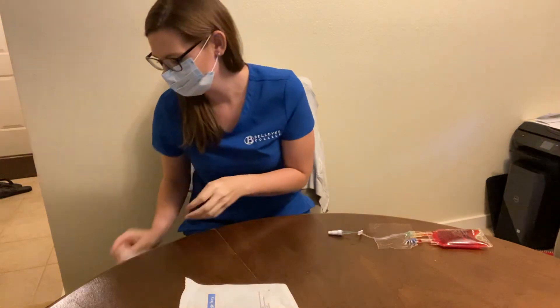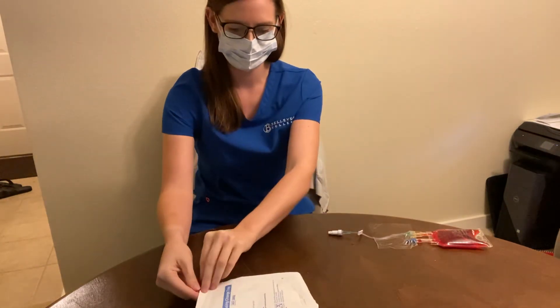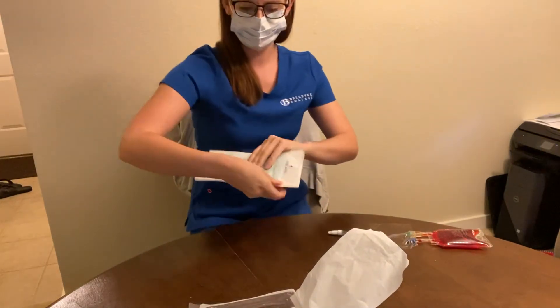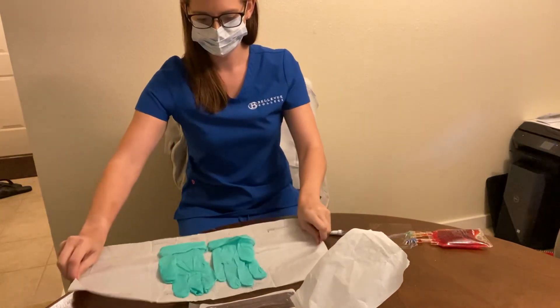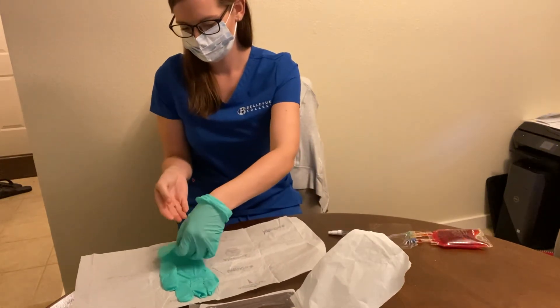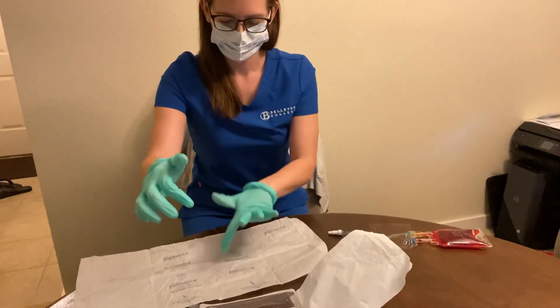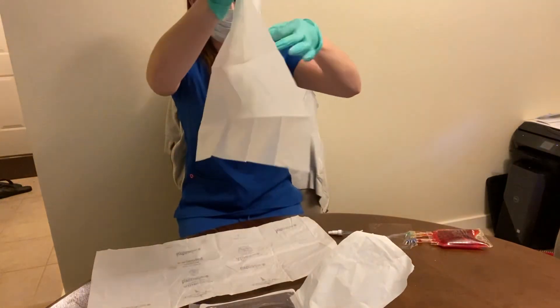Then I'm going to get my dressing change tray. Before I do that, I'm going to remove my gloves and wash my hands. Then I'm going to get my kit, grab my sterile gloves, and this will be my sterile field. I'm going to lay this over the patient.